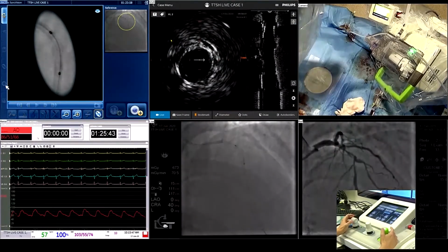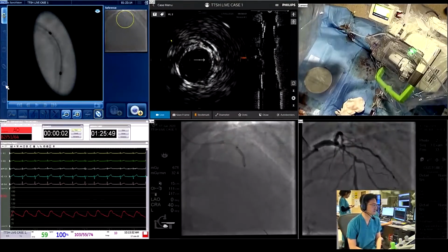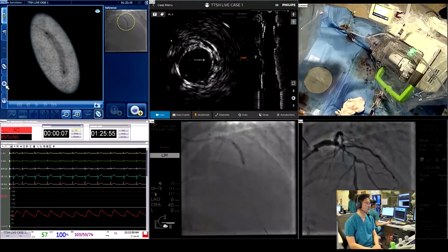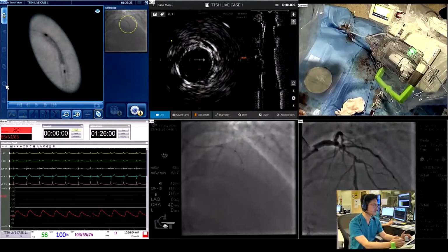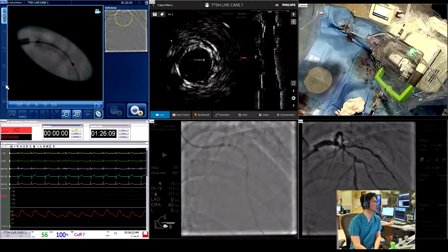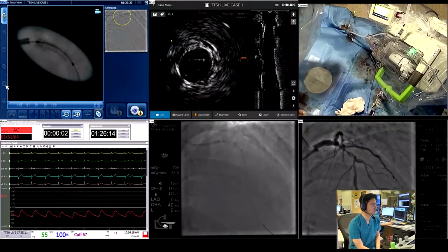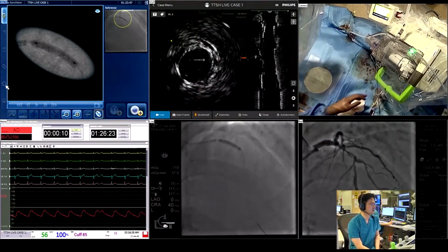Okay, come back with the guide a little bit too. Okay, go up here. Yeah, 16. 16, 18. Okay, store this please, and down. Okay, go up. 18. 18. Yes, please. And down.